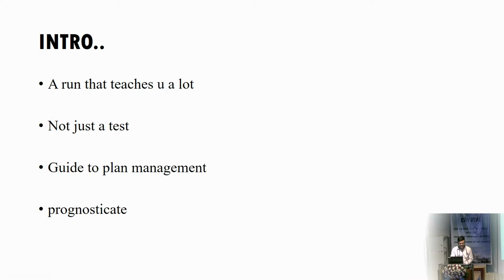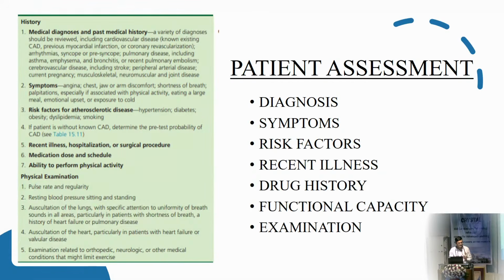Today, I'm going to present a talk on treadmill test, not just another run of the mill. In the treadmill test, we test the physical capacity, the exercise capacity, of the patient. During the test, the heart rate, the stroke volume and various parameters will change, like systolic blood pressure and total peripheral vascular resistance. Taking all those parameters into consideration, we look at the patient holistically, comment on his exercise capacity, and decide whether the patient has any disease, like coronary artery disease, and so on.